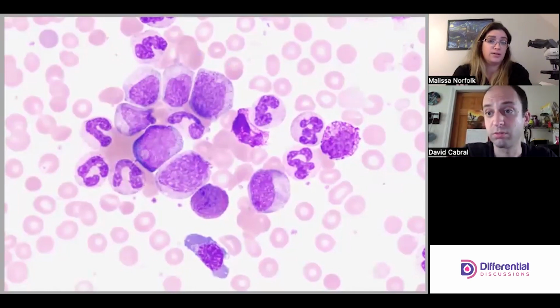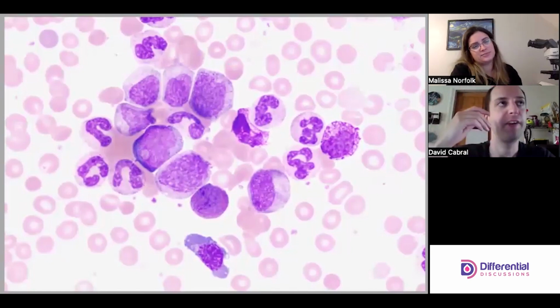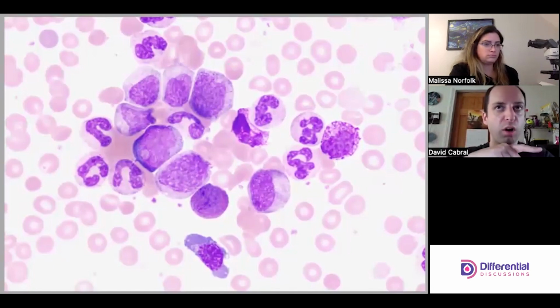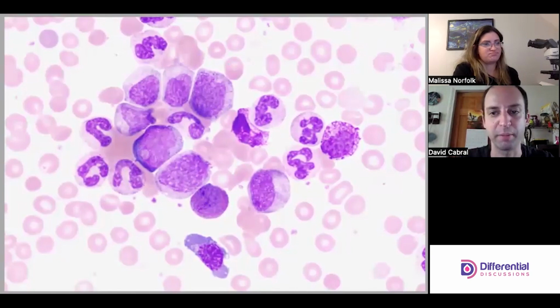That's three into one. That's true. And in that case, you're just like, meh. But also, if it's 2% more myelo, less meta, and then inverted, it's probably not going to make a big difference.